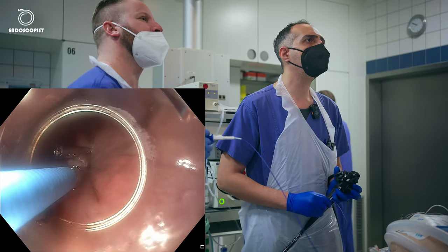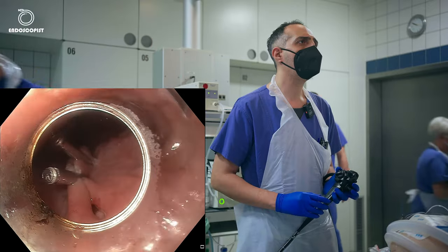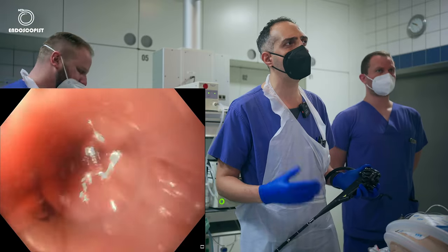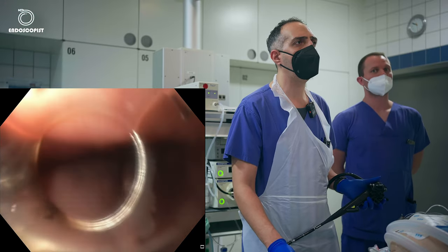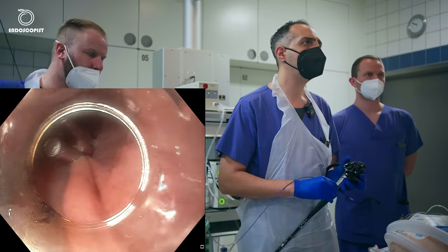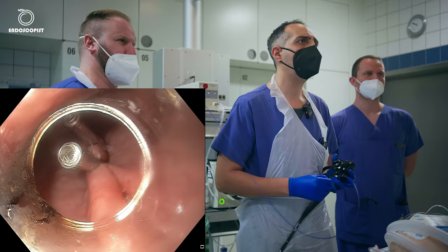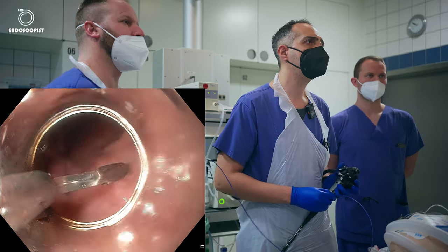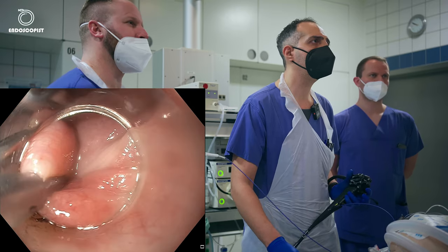So, very nice. If your incision is something like 4 centimeters, it will be very difficult to close, and you are always uncertain if what you did is enough or not. That's what we have learned with time, to keep the incision small and clean. It's very important to take the two edges with the clip.